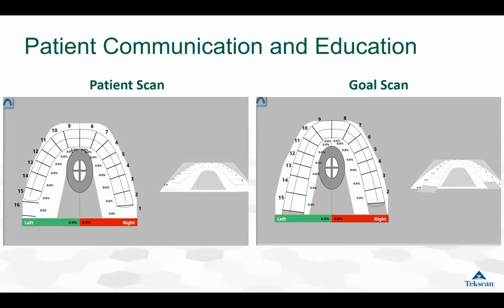So often, patients don't notice the signs and they don't have symptoms yet. So you as a dentist can see the problem unfolding right in front of you. But in order to help your patients understand and own their occlusal problems, what many T-Scan dentists have done is they started taking a quick T-Scan movie and they're using that to help communicate and educate their patients on the patient's bite. So this here is a perfect example of how a patient can quickly understand some of their bite problems that might be causing occlusal issues.